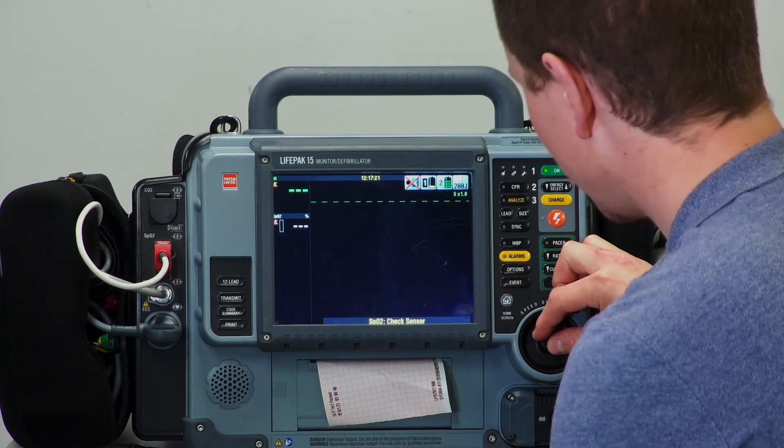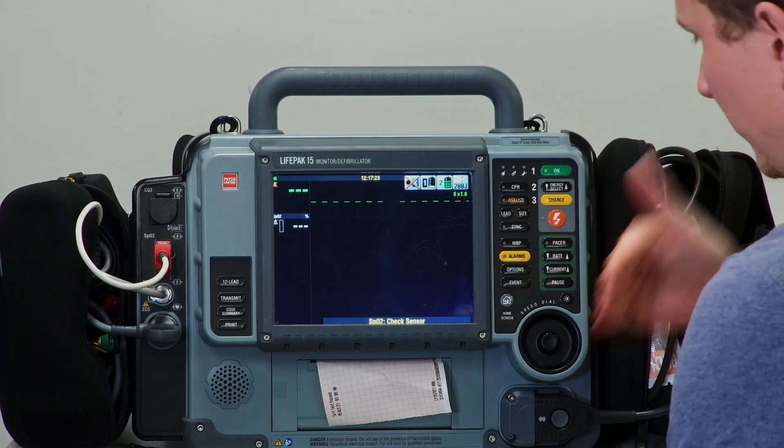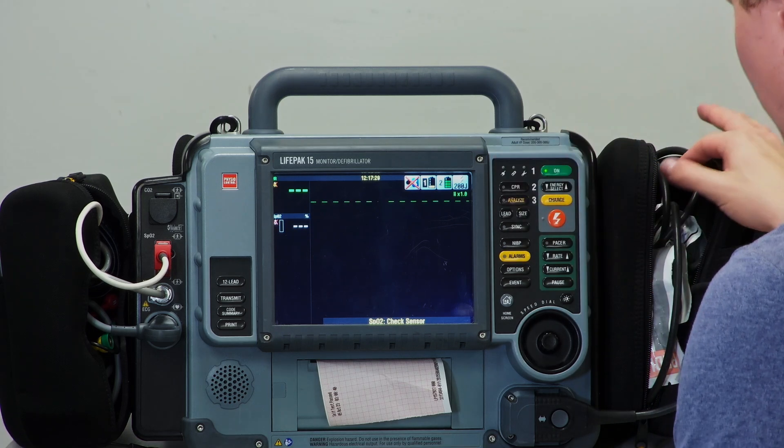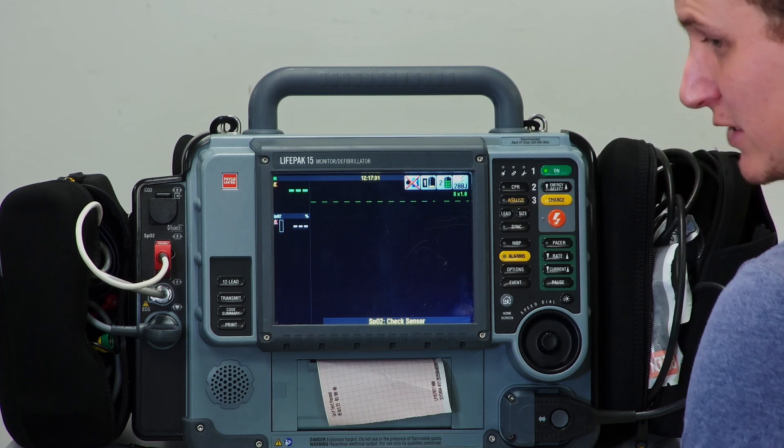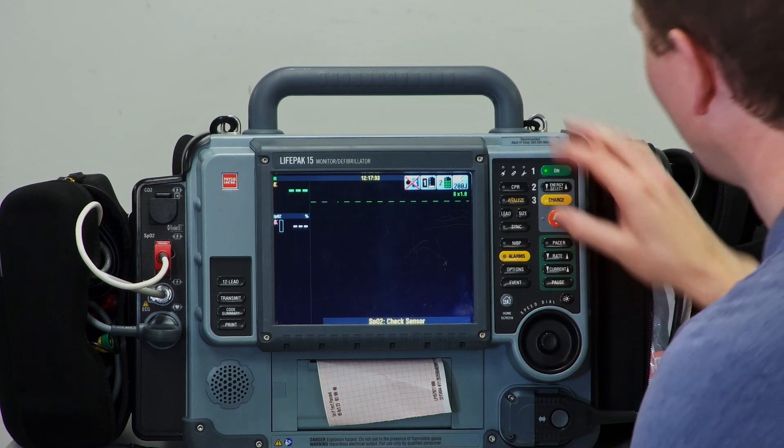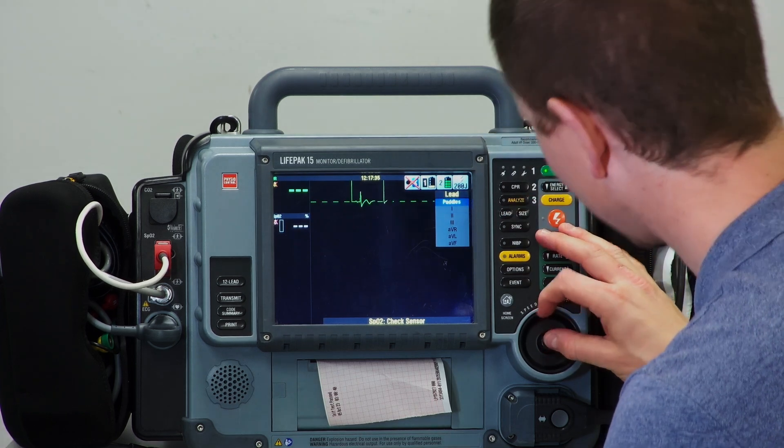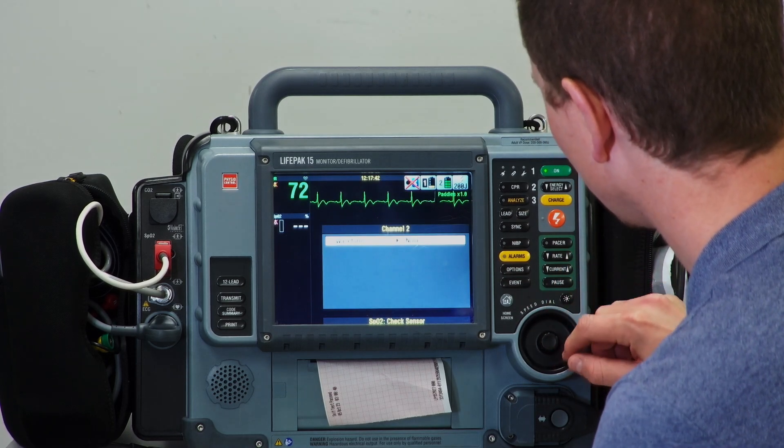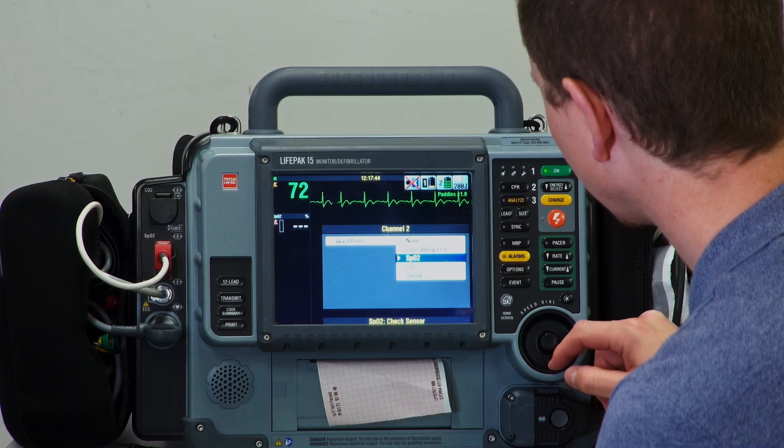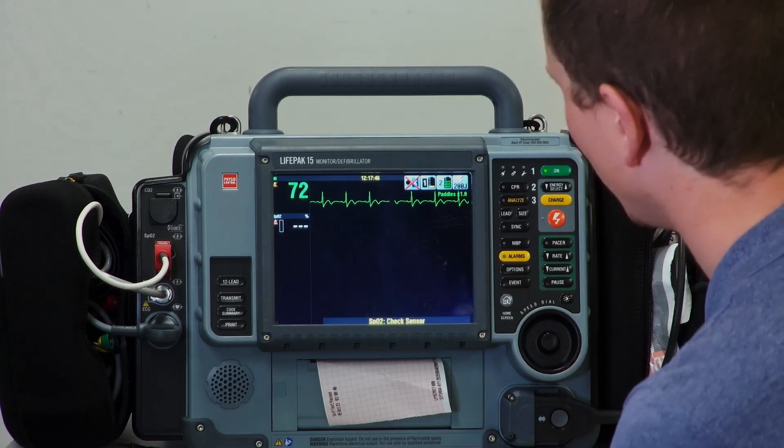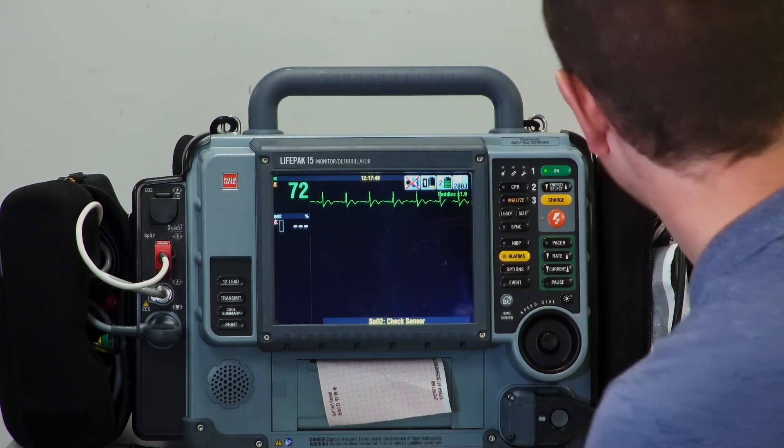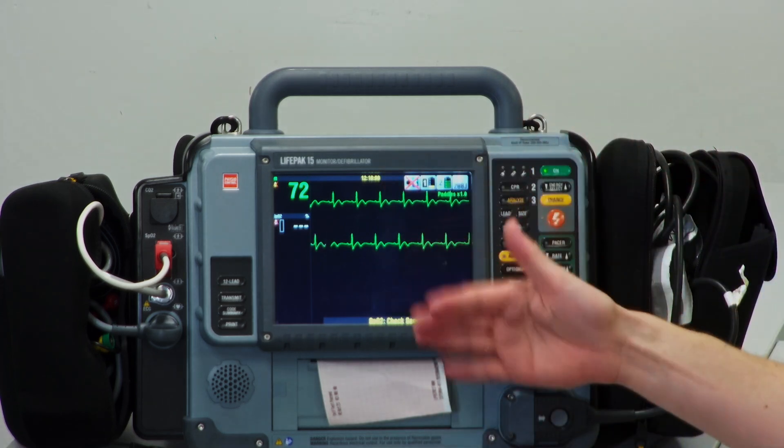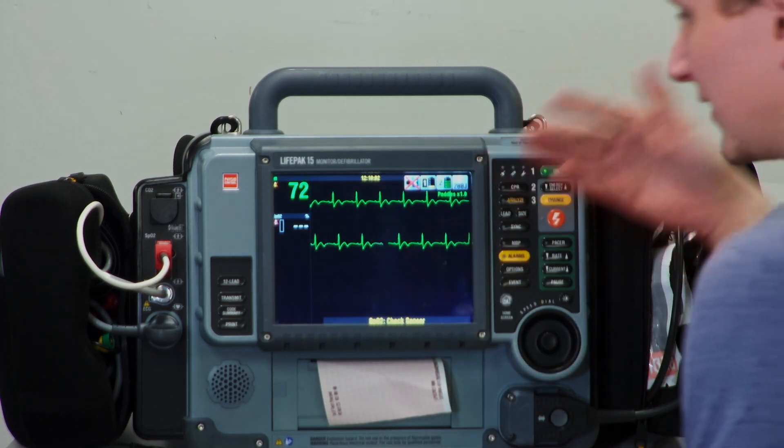The reason we can't see the rhythm being generated is because it's on lead two, but this has been plugged into the cables for the paddles or pads, so we need to go to lead and select paddles. Now we have an ECG. I'm going to scroll down, select, and say cascading ECG—that's just so we can see more of an ECG on the screen. Now that we can see an ECG, we've selected the right lead.